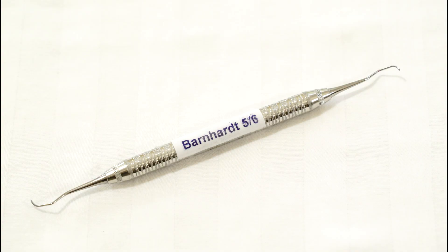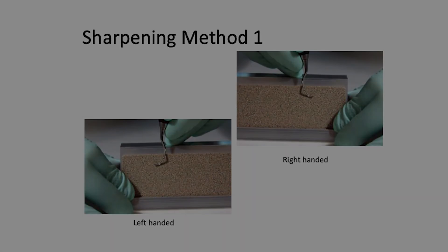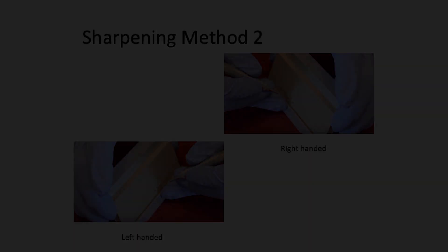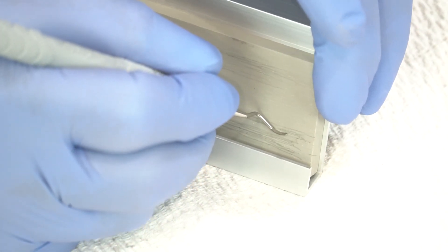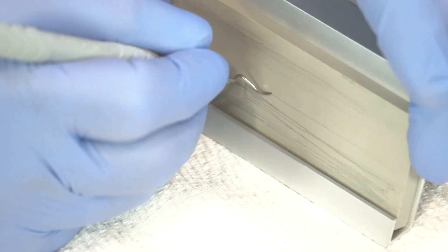This is the Barnhart 5-6, another universal, which is double-edged on each end. Starting with method one for this end: heel third, middle third, toe third, toe. The other end and edge is the same. Method two: heel third, middle third, toe third, toe. Method three: face parallel, fulcrum on the table, heel third, middle third, toe third, toe — moving the entire fixture.